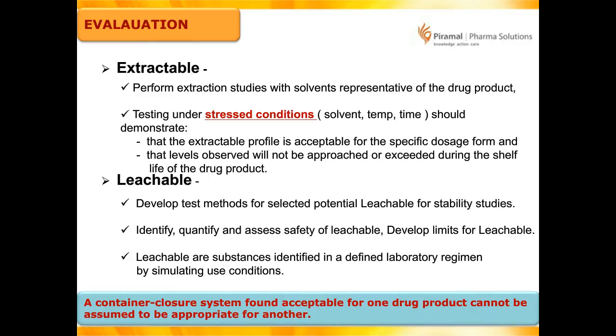Hope I am making myself very clear. The extractable and leachable study for the individual drug product needs to be carried out, and you need to have an independent report for that particular drug product.